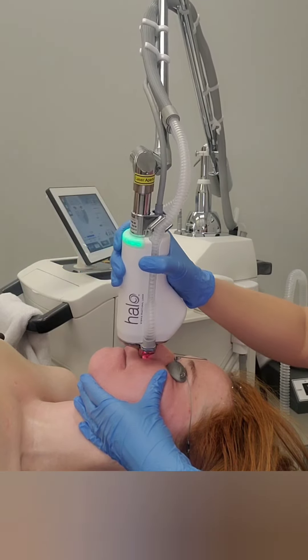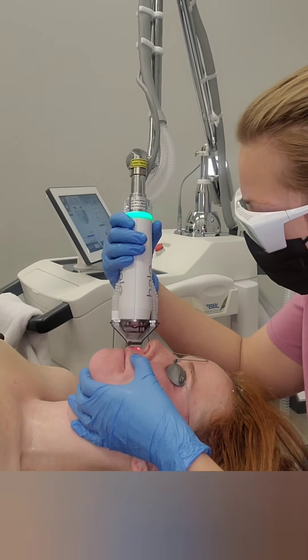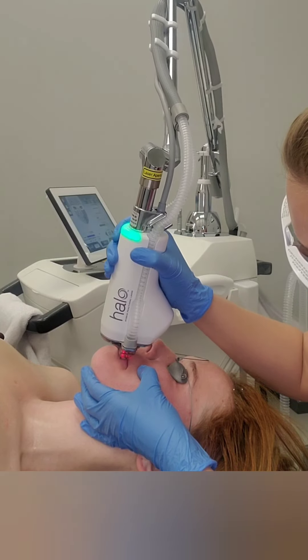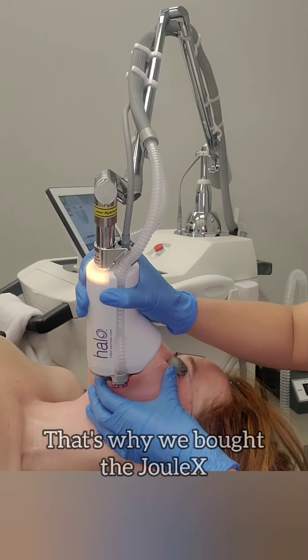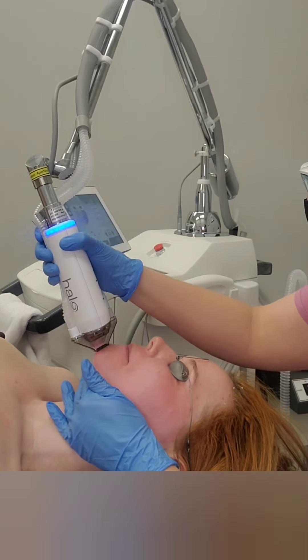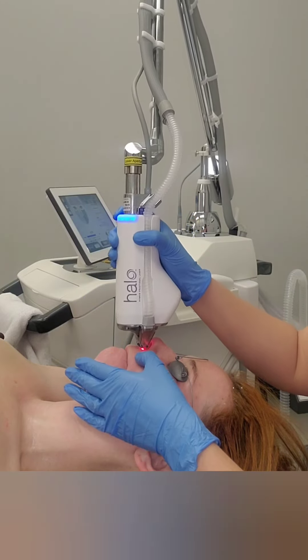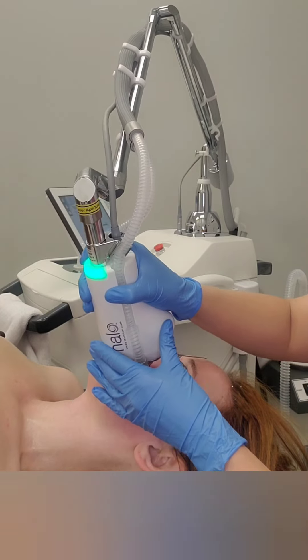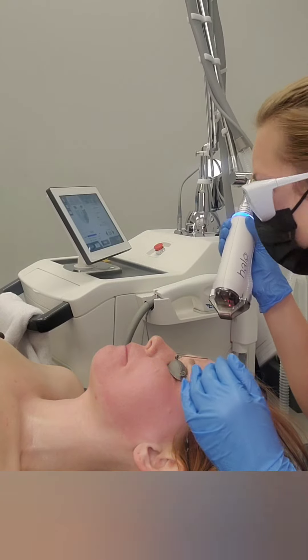I will fight you — Cytan is the best. Even one of my doctors who was a little skeptical was very pleasantly surprised at how good this actually is. If you're an old-school doctor wondering if it's as good as the ProFractional — you can crank this thing up and be very aggressive. I highly recommend going to one of their conferences; if you reach out to a rep and show interest, they'll often give you a free ticket. They'll let you get hands-on experience, and clinical training is included with every laser purchase.